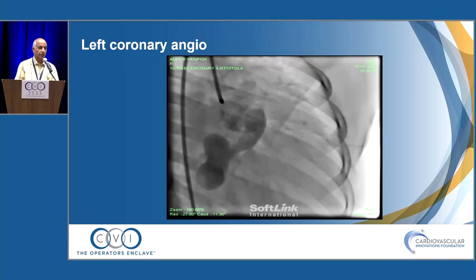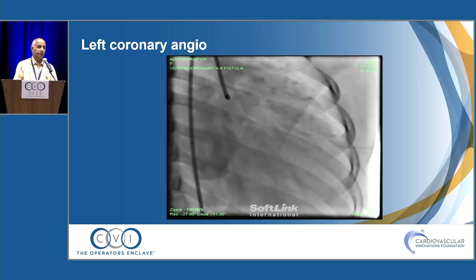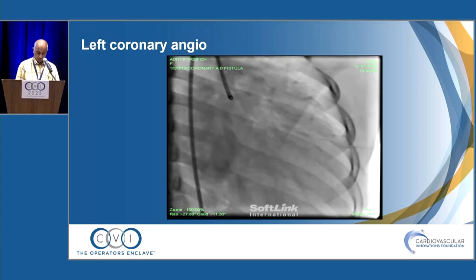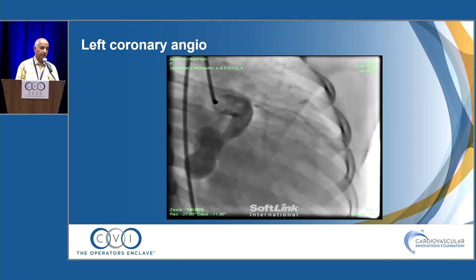On color Doppler, there are increased color flow signals from the coronary sinus. We took the patient for angiography and found a large left main, a very small left anterior descending, a usually dilated left circumflex, and a large fistula connecting to the coronary sinus. The patient was taken for device closure.